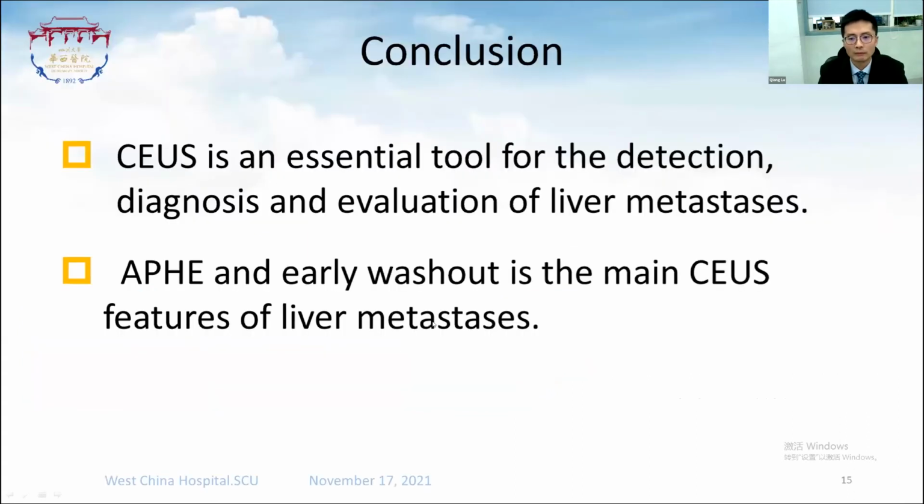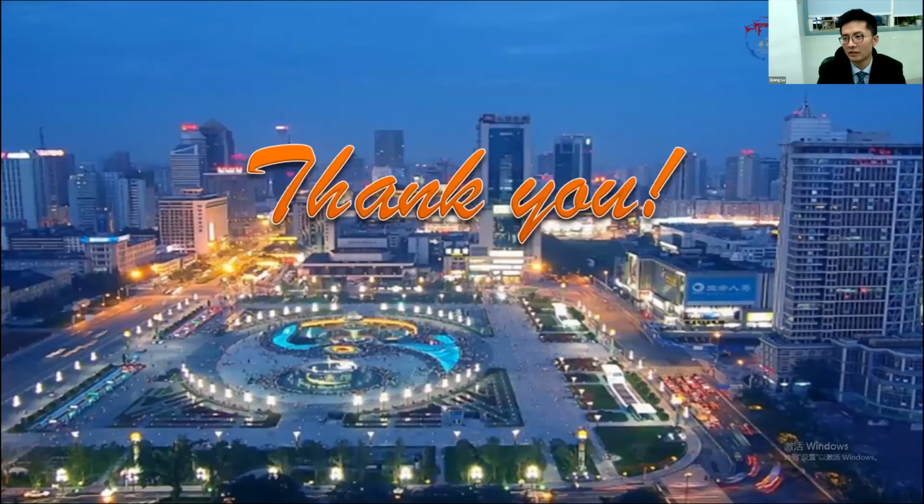So in conclusion, contrast-enhanced ultrasound is an essential tool for the detection, diagnosis, and evaluation of liver metastases. And arterial phase hyperenhancement and early washout are the main contrast-enhanced ultrasound features of liver metastases. Thank you for your attention.